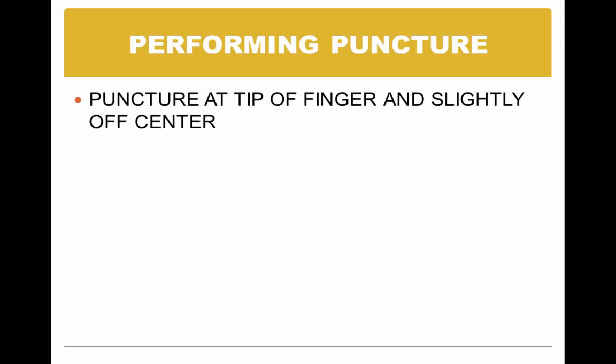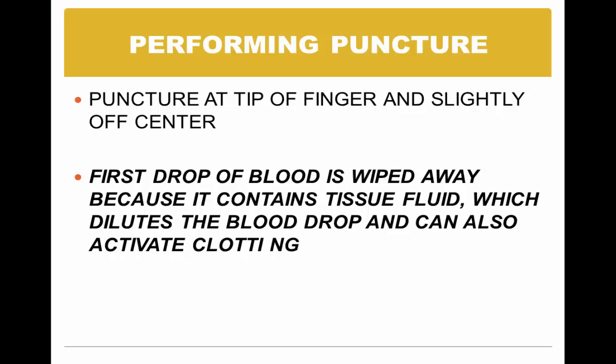Performing the puncture, you want to puncture at the tip of the finger and slightly off center. So go to the tip and go a little off center. That's where you want to puncture that. I'm reading this a couple of ways.